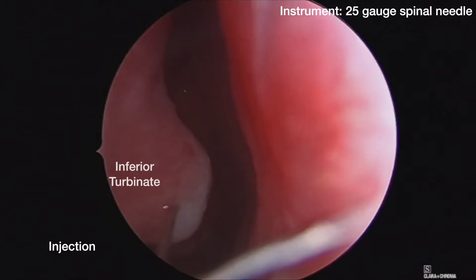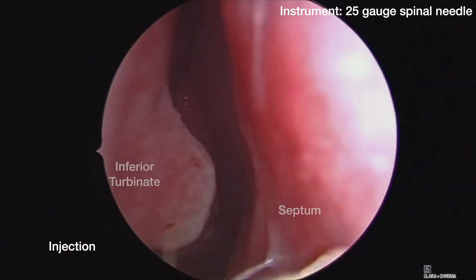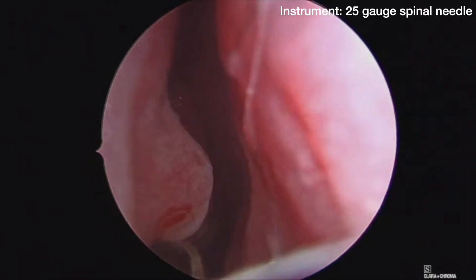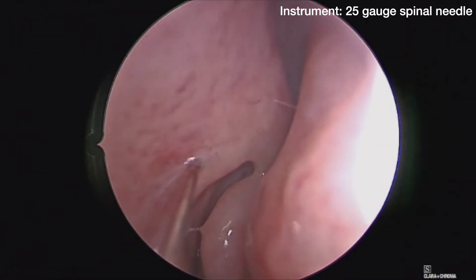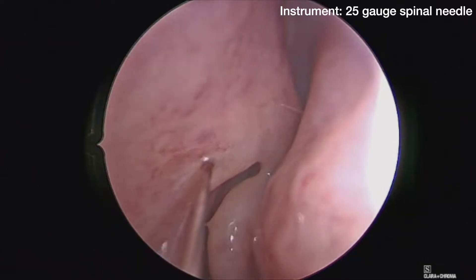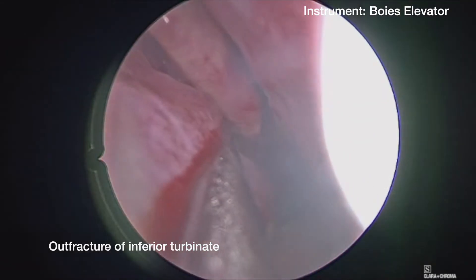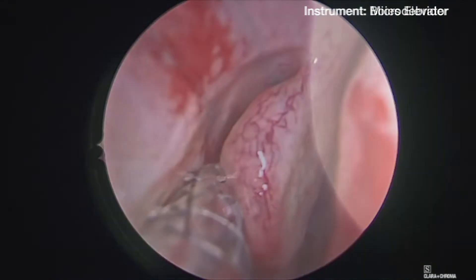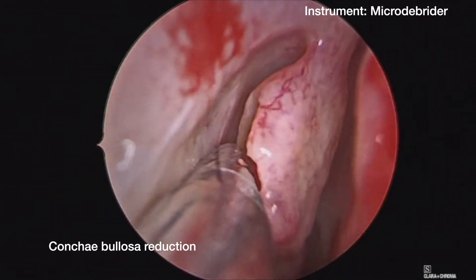Here is a right-sided endoscopic view with a zero-degree endoscope following decongestion with 4% topical cocaine. Injection is performed with a spinal needle in the head of the inferior turbinate and the middle turbinate near the area of the axilla. Inferior turbinate outfracture is performed to increase the working room.